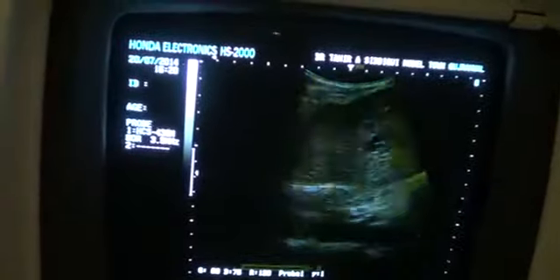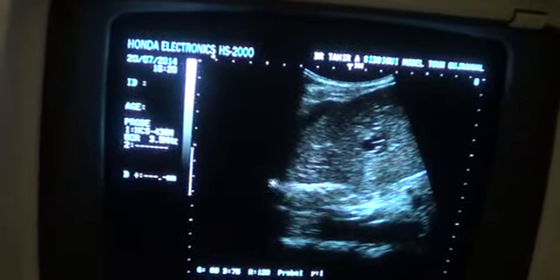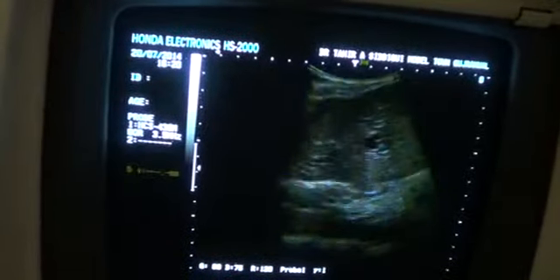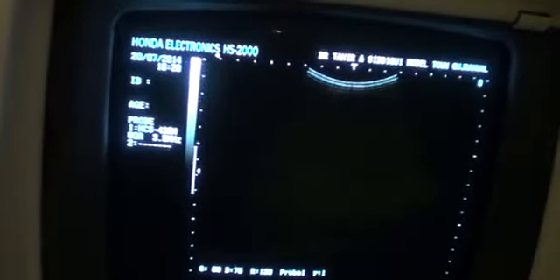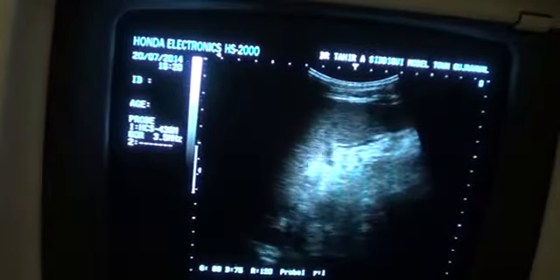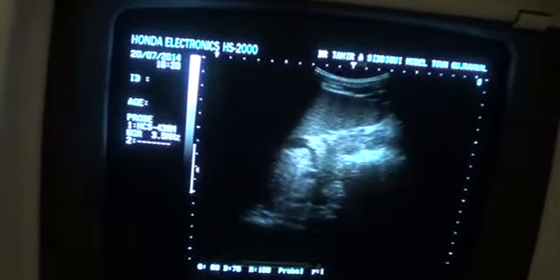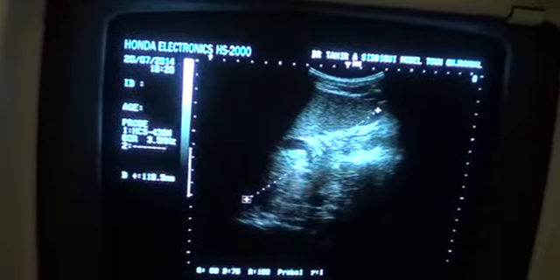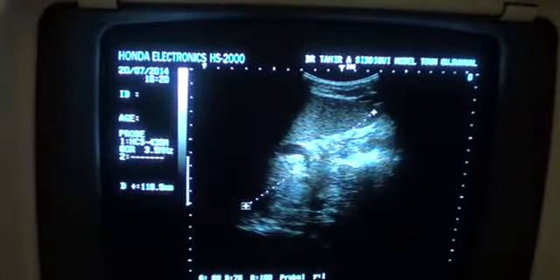I see the caudate lobe as normal. This is the caudate lobe or segment 1 of the liver. This is the ligamentum venosum, the left lobe of the liver in longitudinal section. And this is the transverse section of the left lobe of the liver. This is the spleen, and spleen measures from pole to pole 11.8, up to 12 is normal, so the spleen is not enlarged.